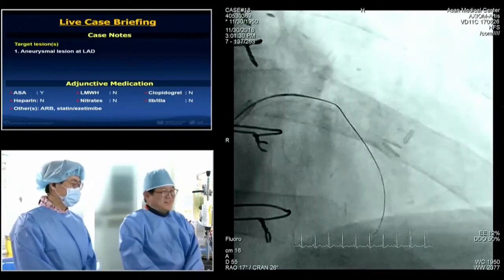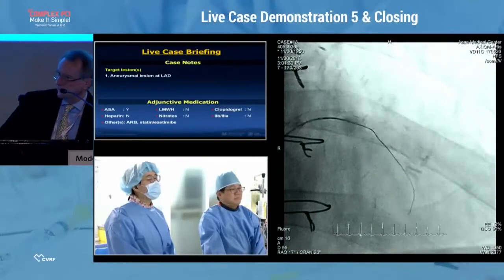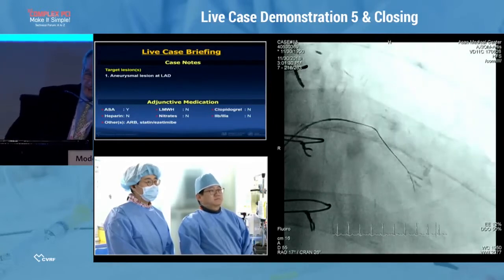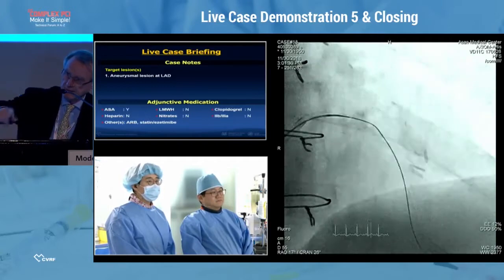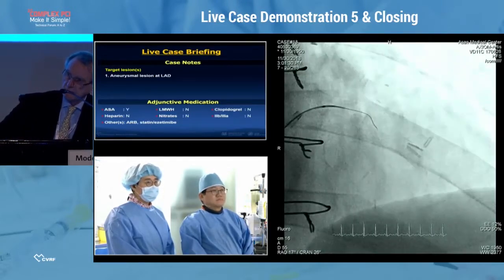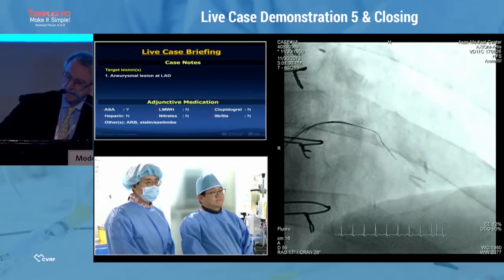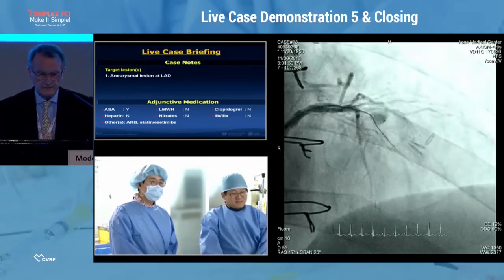And sometimes it can be very time consuming, because when you are inside, you lose steerability and keep going on the walls. Sometimes it makes a 360 curve going down, but then you uncoil the curve. At the end, you succeed, but it can be time consuming. Which wire is this, the XT?